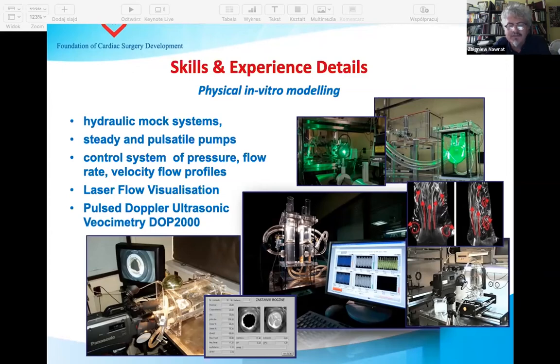qualification test. A few minutes after our colleagues in the laboratory prepare this valve, we can test its function, opening, closing, etc., in our tester. After a few minutes, these valves go to the next procedure. We have the possibility of preparing a passport for the valve and calculating the parameters, and based on this, and on histopathologic and microbiology tests of the tissue, because we use natural human tissue, the decision is made whether this valve can be used for humans. Currently, we have stopped this project from the economic point of view, but we worked on this valve for several years.